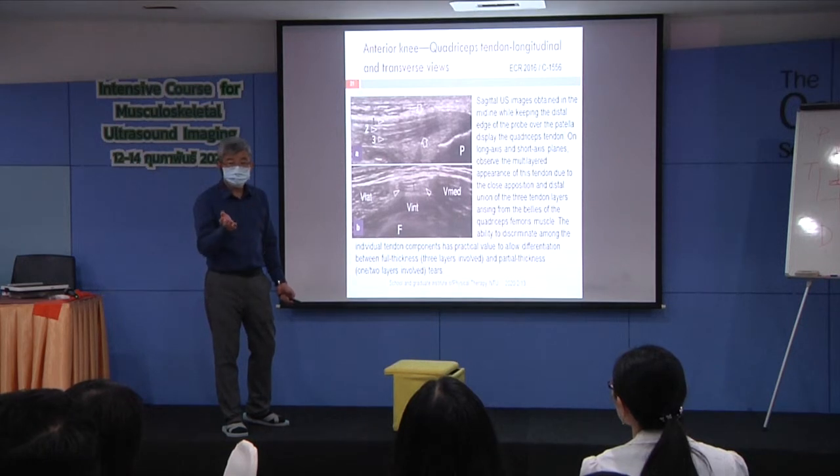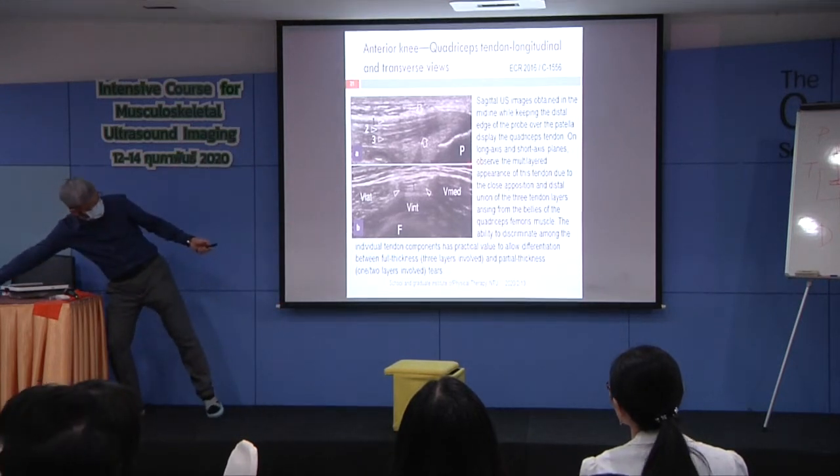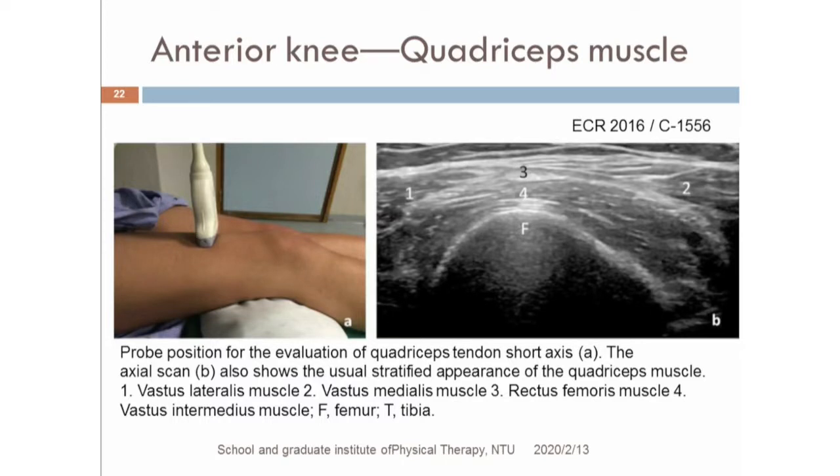There is no way for ultrasound to measure the thickness, but you can measure the curvature of the medialis. Use free software like ImageJ, right? AutoCAD, but someone just reminded me, AutoCAD is not free. Okay. But my student did not tell me this.